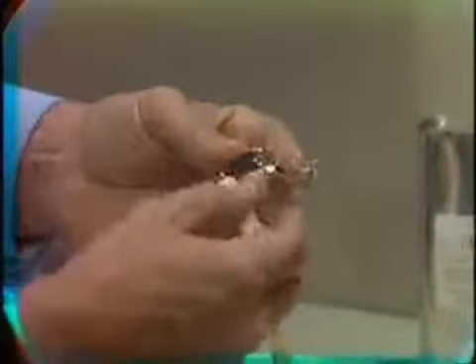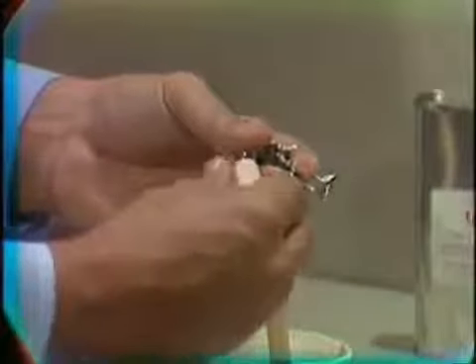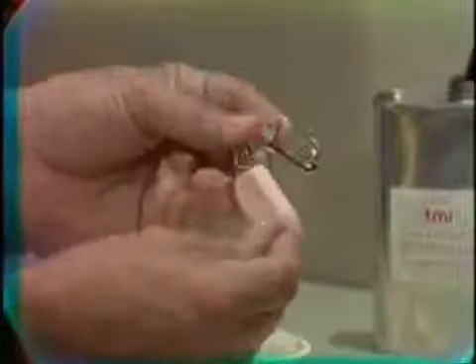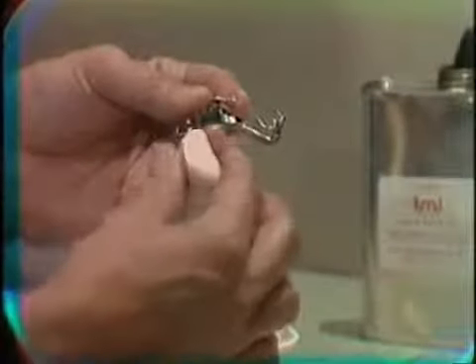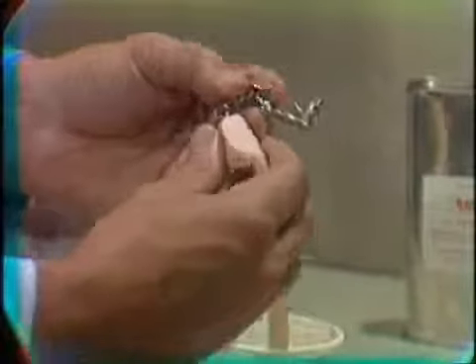I'm trying to establish an occlusal plane slightly higher than the patient's mandibular occlusal plane, so that when she bites into it, she will register the indentations into this surface. Try to make it wide enough so that the entire opposing surface is recorded.